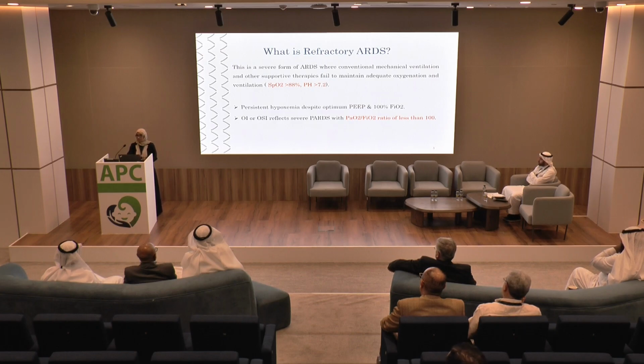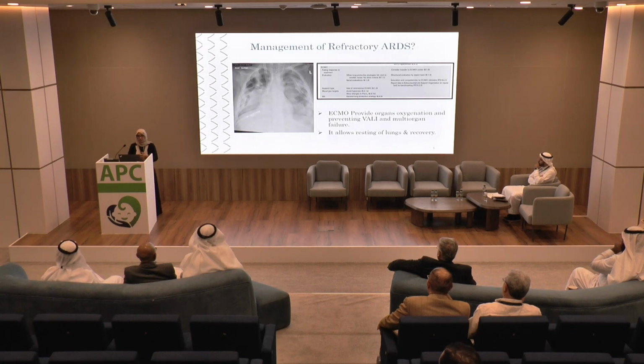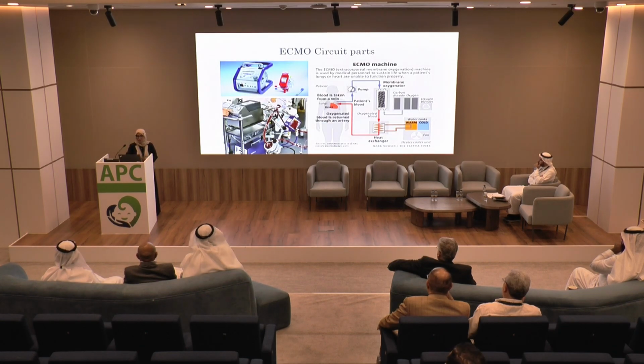So a PF ratio less than 100, or an oxygenation index, as PALICC says, beyond 8 and progressively increasing. I'm not going to wait for higher numbers, because maybe the patient will already be very bad. We have to use a different technology where we divert the blood outside the patient using cannulas and get a membrane to oxygenate this blood like an artificial lung: add the oxygen, remove the CO2, anticoagulate, and put it back into the patient's body. So respiratory ECMO is one technology that is advancing and very helpful for patients in refractory failure, and we need to move forward as PALICC recommended.